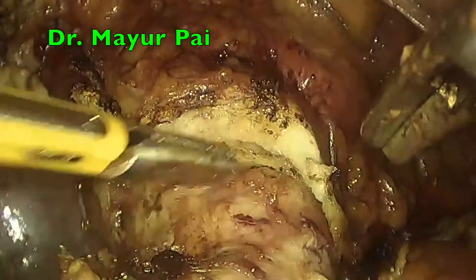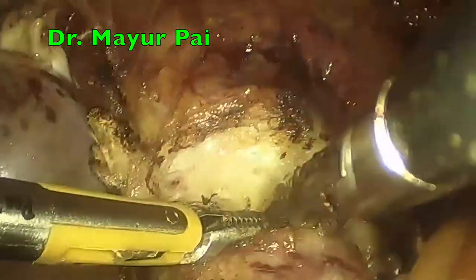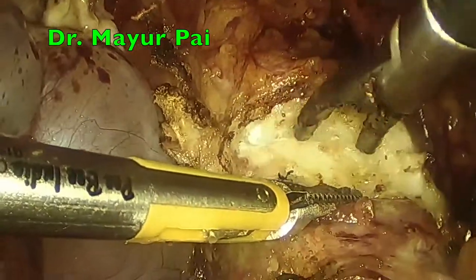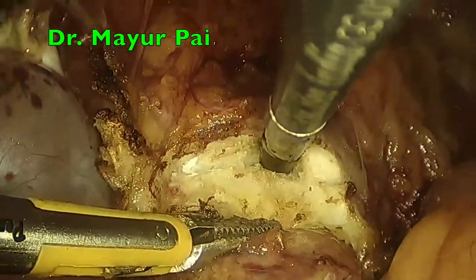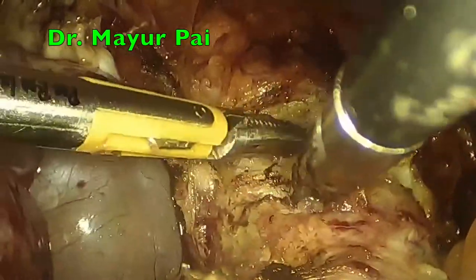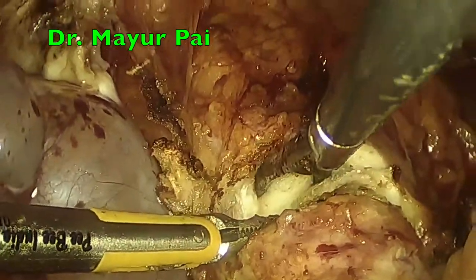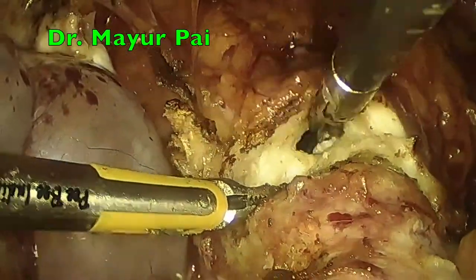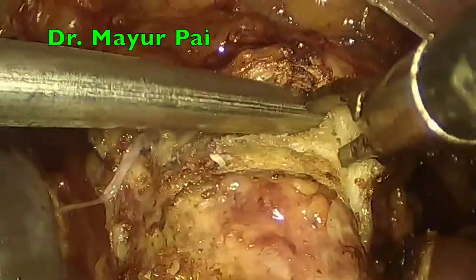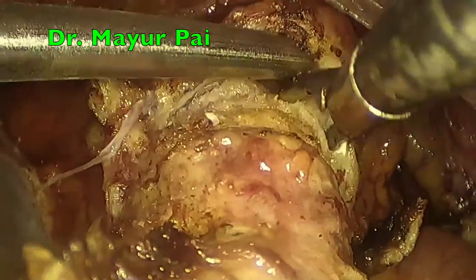Here you can see that we have introduced a swab on a sponge holder to delineate the fornix better so that maximum length of the vagina can be preserved. The swab on the sponge holder is only important to cause the colpotomy. Once the colpotomy is done, we have a very good idea about the length of the vagina and we can follow the same length throughout.